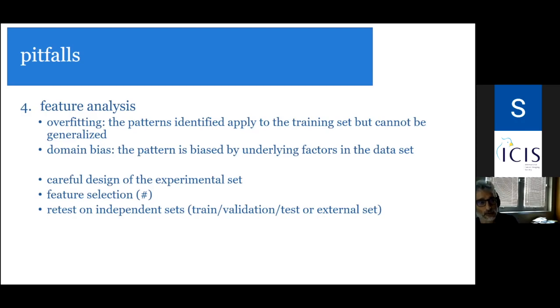This occurs more frequently when you select too many features, and so there is some sort of noise in the radiomic analysis that influences your results.